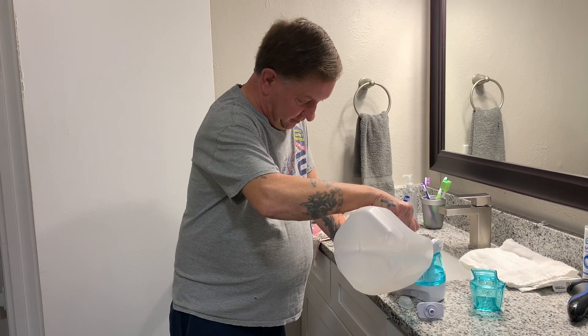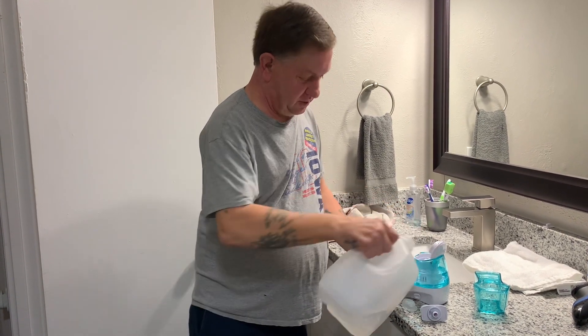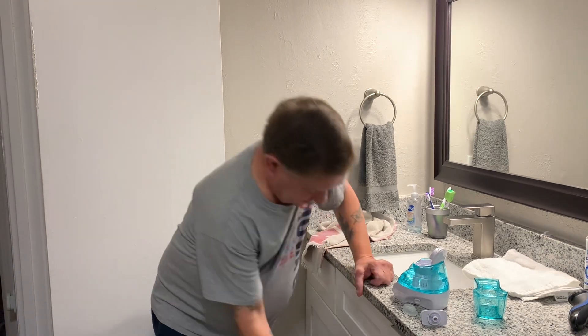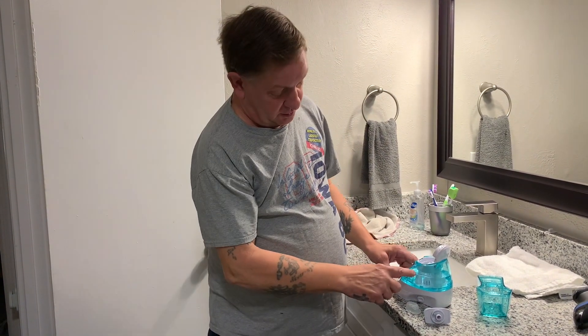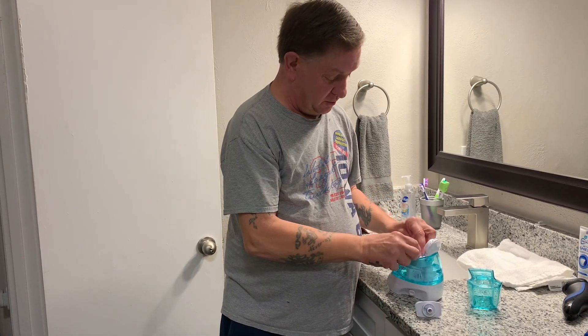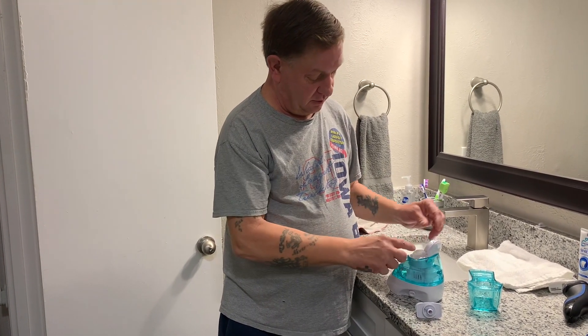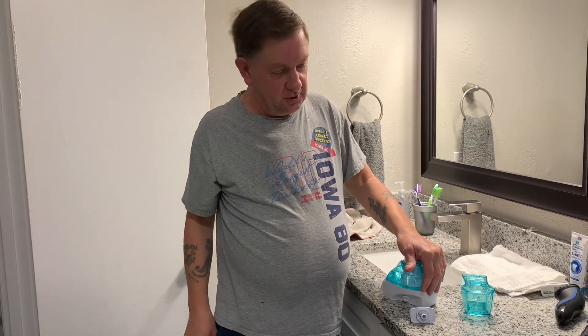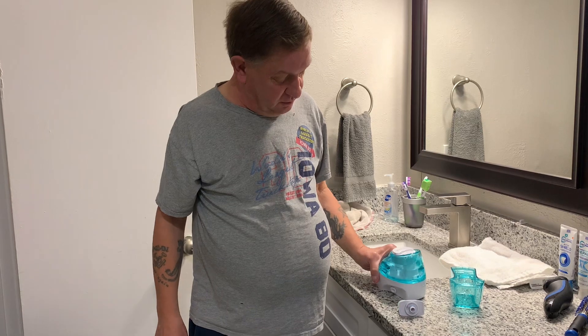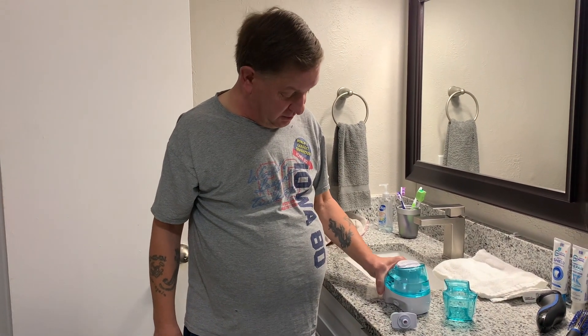That is the only water you can use in here. Otherwise you might get contaminated from your city water. So you fill it up with water to the line, then you take the pod and put it in here and push down — it will release the saline solution into the water. Just give it a little shake, but not too much because it will spill at the top.